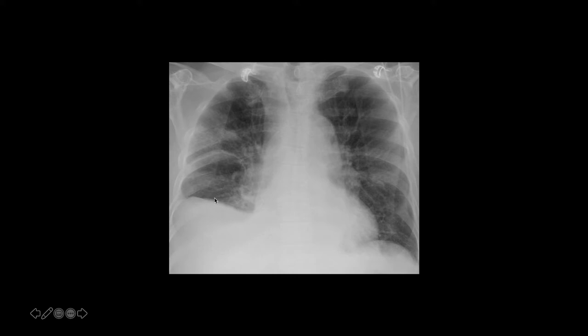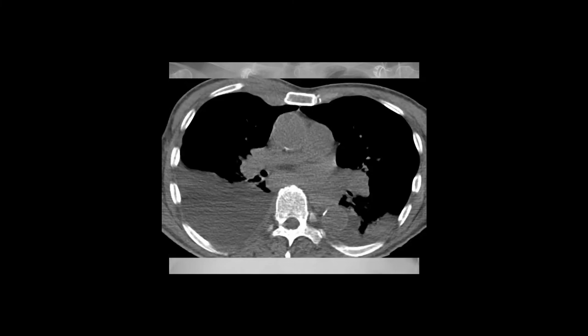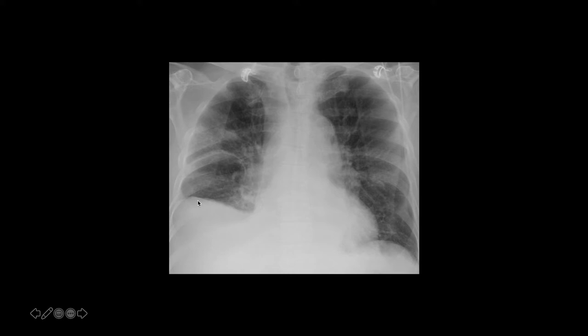What looks like the right hemidiaphragm appears elevated compared to the left side, but it doesn't have the normal shape of the diaphragm — it peaks more laterally, whereas the normal hemidiaphragm should have its peak in the middle. This is a sub-pulmonic effusion, where the pleural effusion is collecting just inferior to the lung. CT done at the same time shows a very large pleural effusion. If the apparent diaphragm doesn't have the right shape, think about sub-pulmonic effusion or lobar atelectasis.